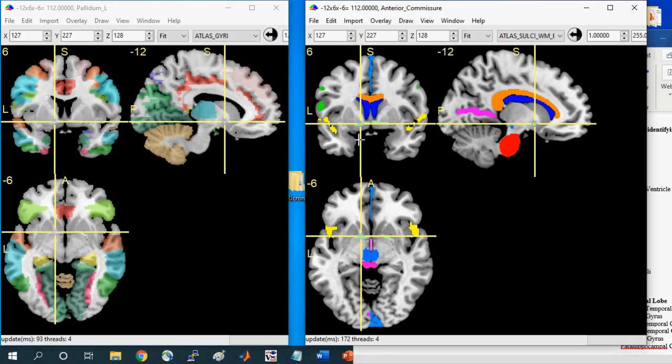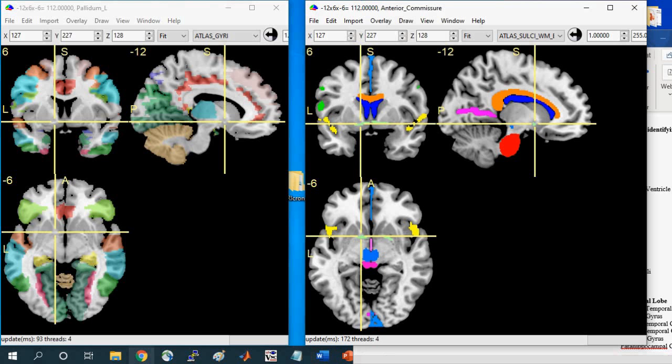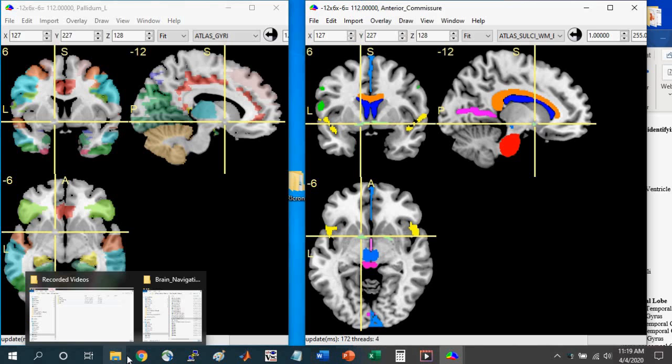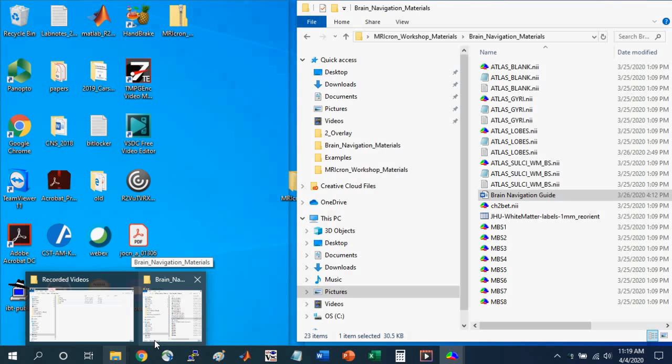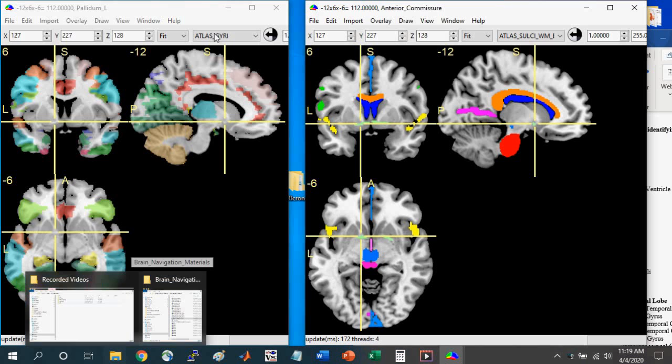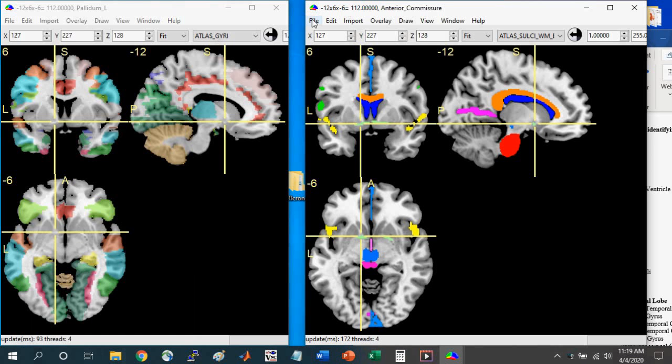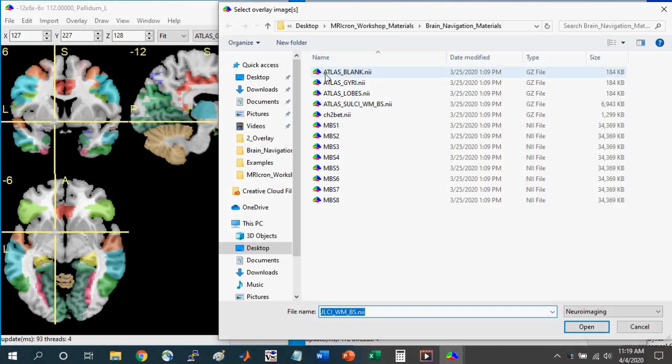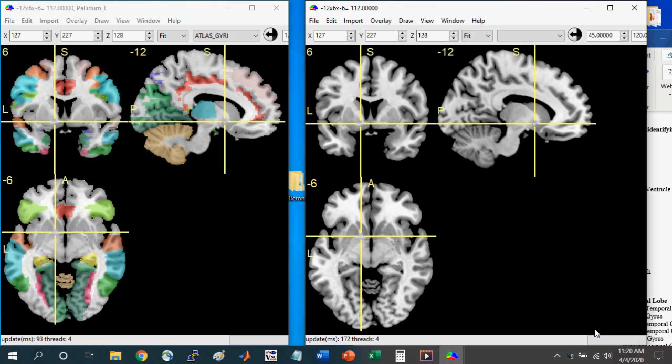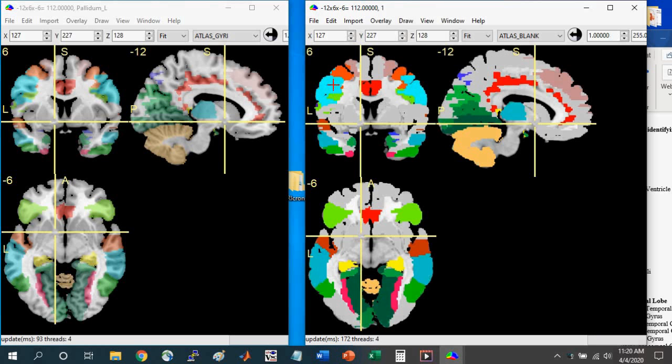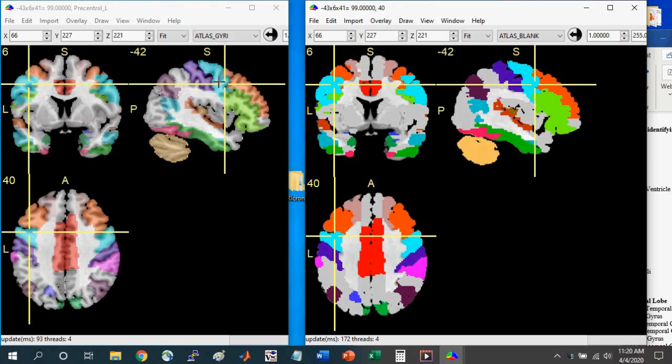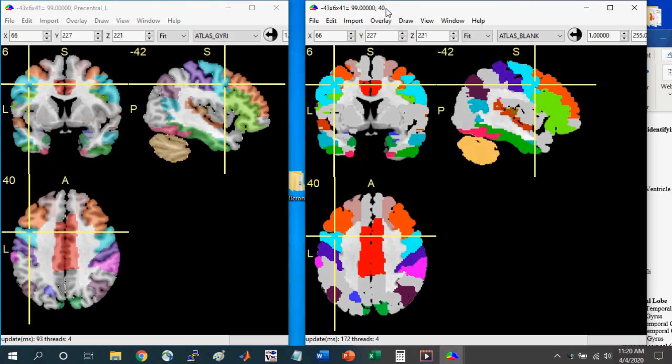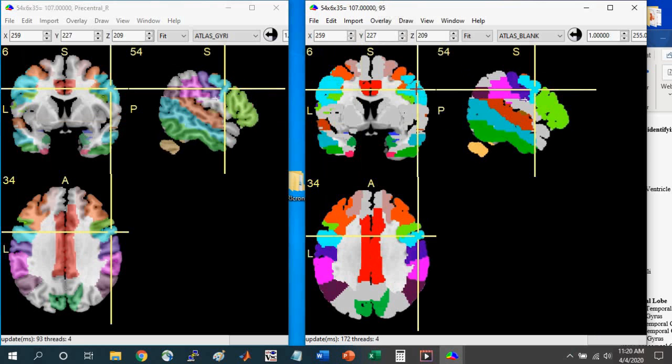So the first step is simply to study. Next, you can use some of the resources that I've included to help in quizzing yourself and to help in studying. So if you go to overlay close, overlay add, and you select this Atlas blank overlay, what this gives you is the gyri overlay, but instead of having actual names associated with the different gyri, it just has a random number. So we can ask the number associated with the left precentral gyrus, in which case this would be 40, or the right precentral gyrus, in which case this would be 95. So this is a blank atlas with a random number to facilitate quizzing.